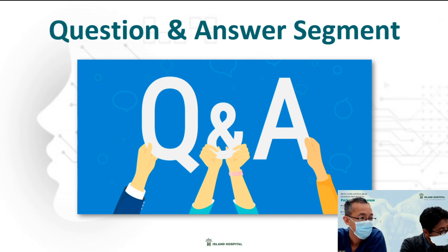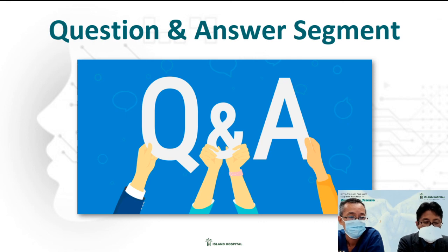Can I find you for my DBS collaboration? I normally advise patients to go back to their own center for tuning or programming of the DBS device, because normally if you have had the surgery in that center, the neurologist or the movement disorder specialist would have done what we call the monopolar review, normally about 1 month after the surgery, where they check each contact, and it takes the whole day to do just that test. So they would know which contact would be the best for you, which contact causes side effects, and at what voltage the device causes side effects.